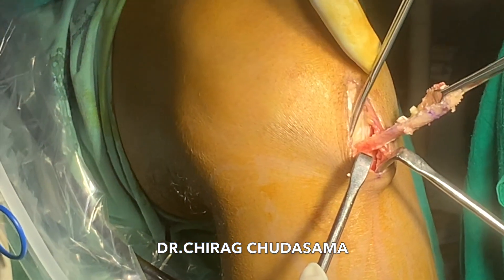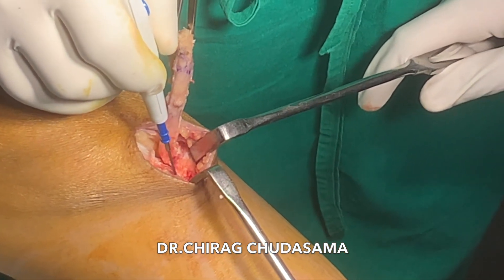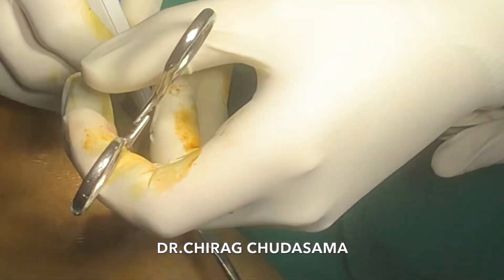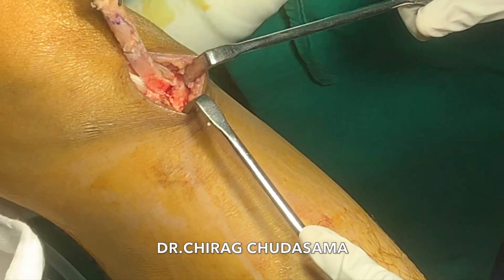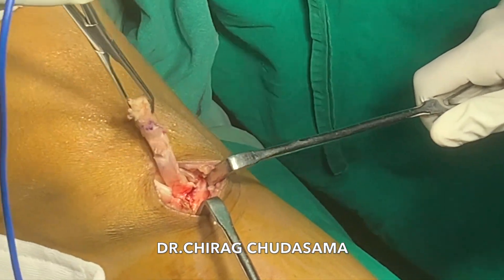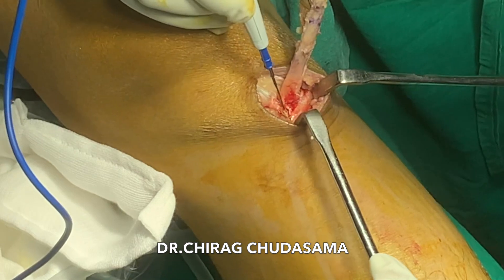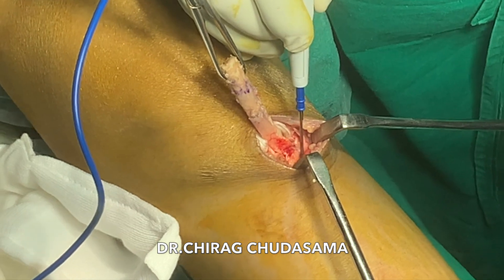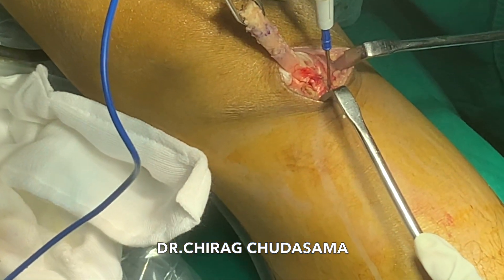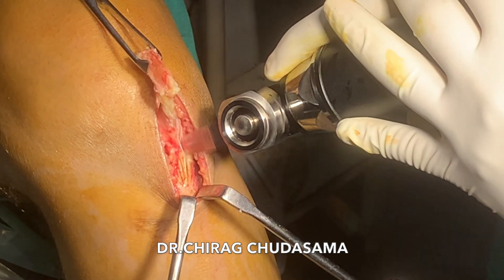You need to use the mobile window of the skin incision — it is hardly a 4 cm long skin incision. You need to adjust the knee position. I harvested the patellar tendon in flexion position. Now to go further down, I do a little bit of extension of the knee, around 20 to 30 degrees of knee flexion, so I can retract the skin down more.